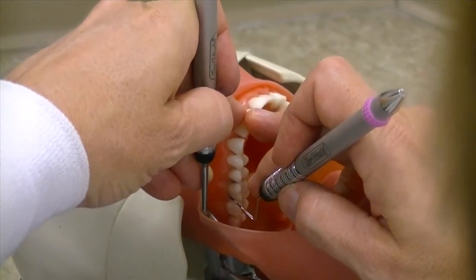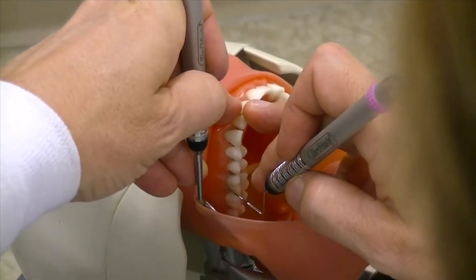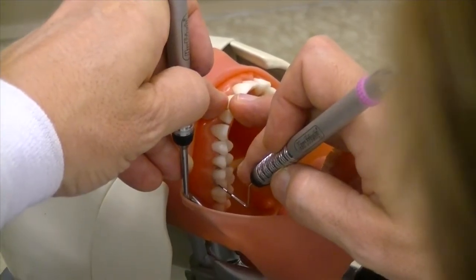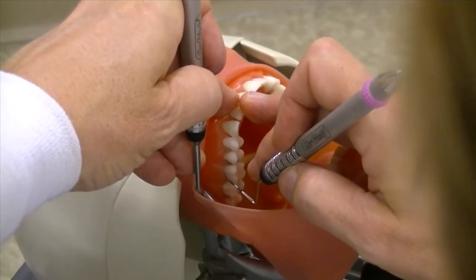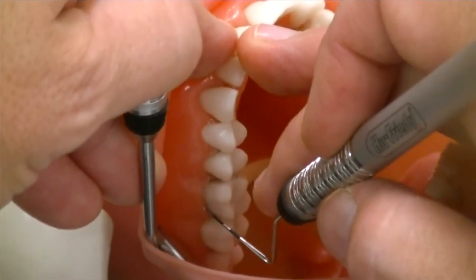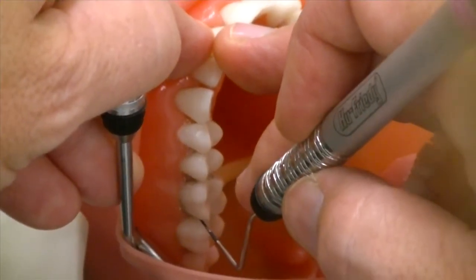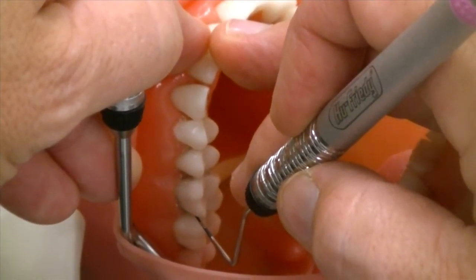Inserting at the distal line angle, keeping your hand down on the distal so that you're laying the probe right in between the tooth and the papilla and staying in contact with the tooth the whole time. So inserting and then it's walking, bobbing strokes to the contact and then a slight tilt interproximally.